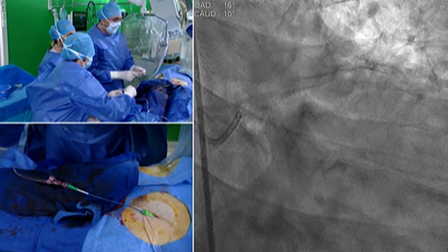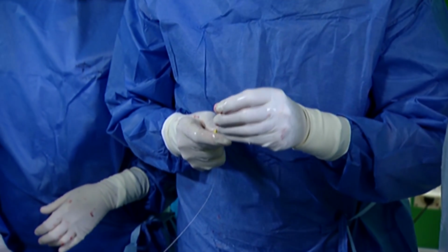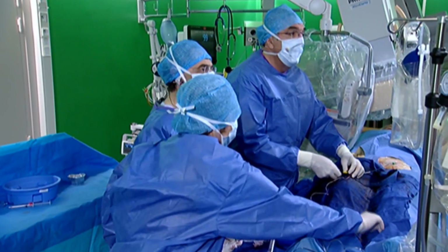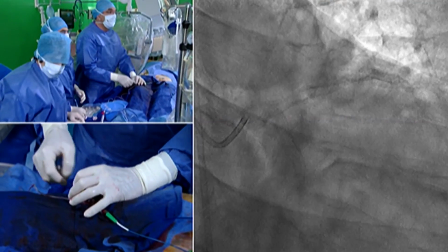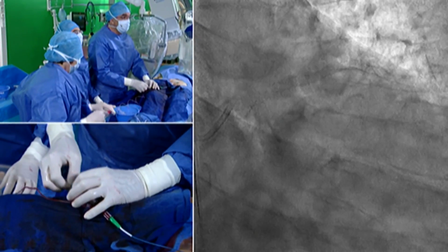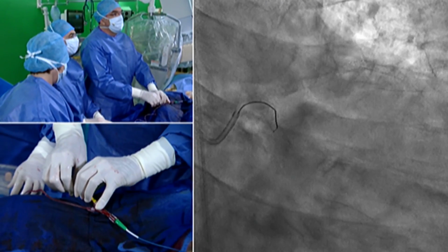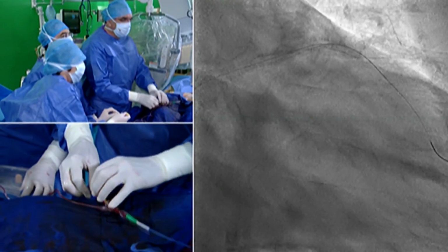So now what we can do is to place a single wire in the distal LAD. With the single wire, we will check all the mid-proximal LAD and the left main bifurcation. And at the end, I will finish with a single short balloon in the proximal left main in order to be sure that particularly the ostium, the struts at the ostium, are correctly open. So you could see that it's open. Everything is open.